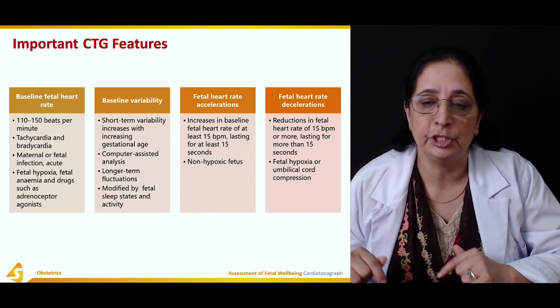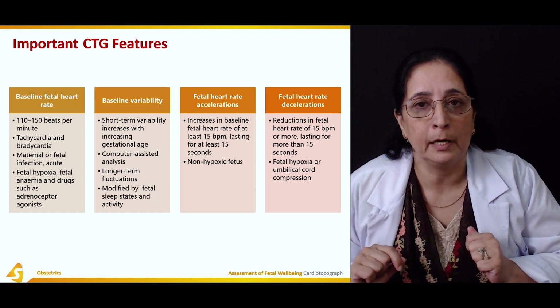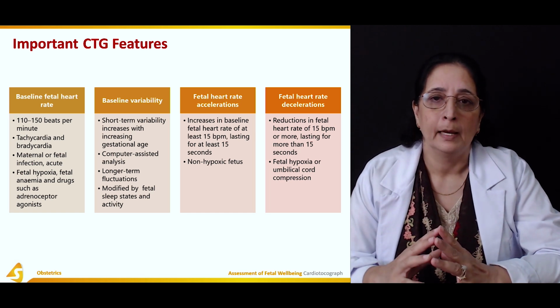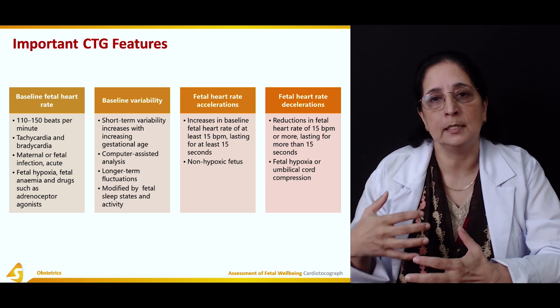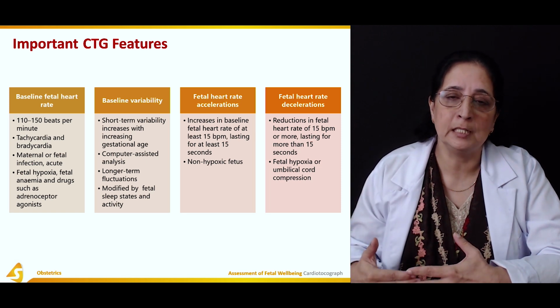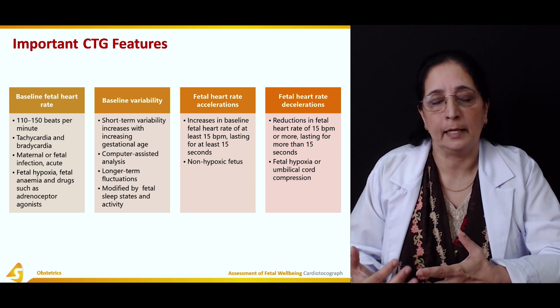Deceleration or decrease is a reduction in heart rate of 15 beats per minute for 15 seconds. And in this condition, hypoxia is present and there is umbilical cord compression. So if cardiotocograph is performed and baseline is increased or decreased, then it should be alarming, especially with deceleration. Heart rate decreased by 15 beats per minute in 15 seconds. That's alarming.